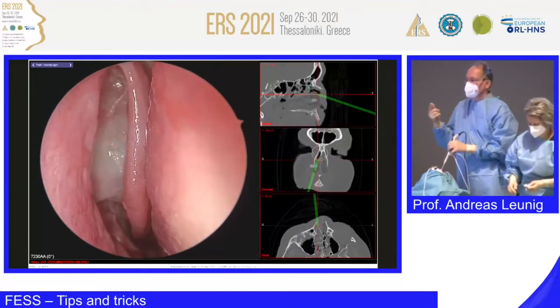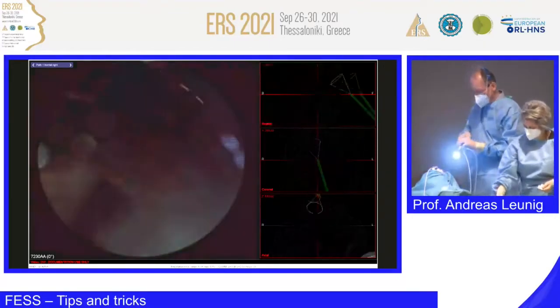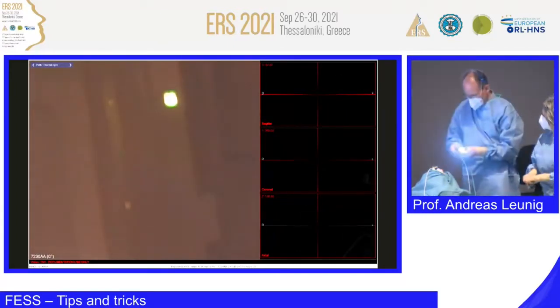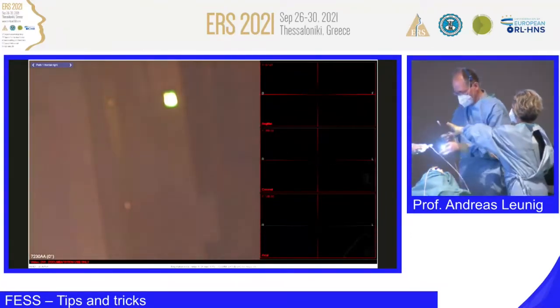Straightforward. But what would I do in a surgical case? I just do exactly what I do during surgery. Now, I come back with my zero degree endoscope, and I come again with another endoscope. Oops, like this here, that's for you.